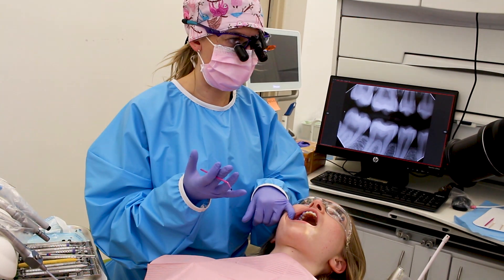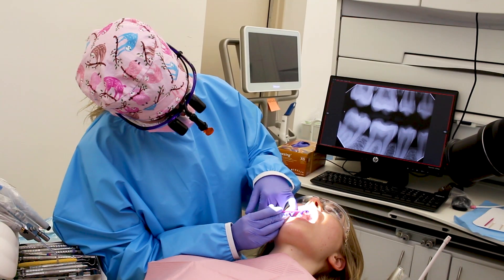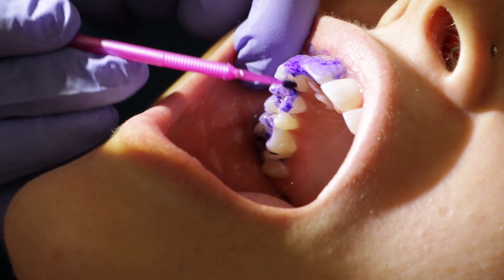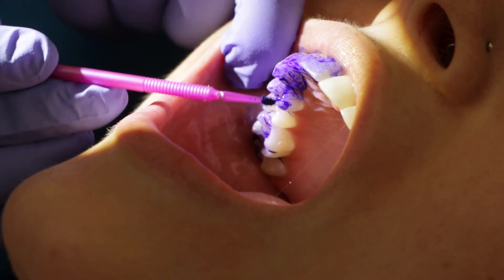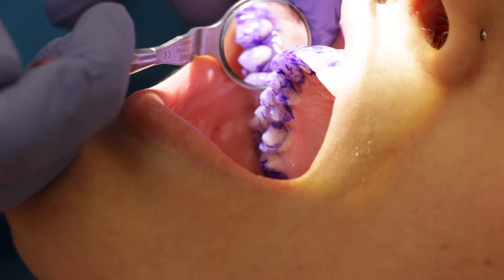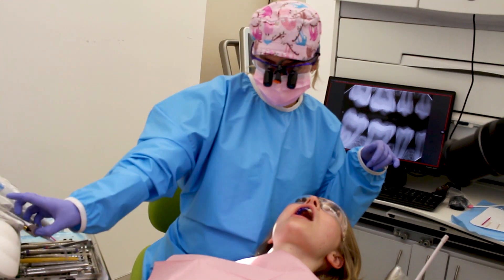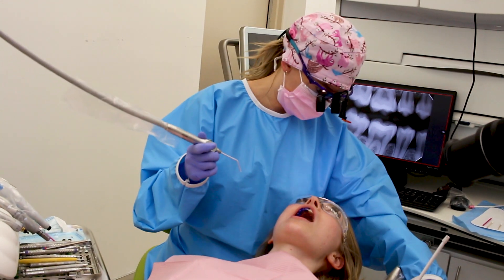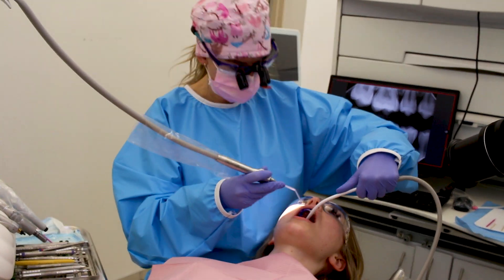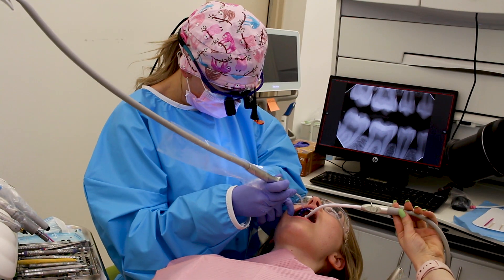Normally you would do the full mouth, but for the video I'm just going to do this a little bit on this corner so you can see how it works. Before we rinse it, it basically stains all the teeth a nice deep purple color. We'll grab our air water syringe and our saliva ejector, and we're just going to rinse it.